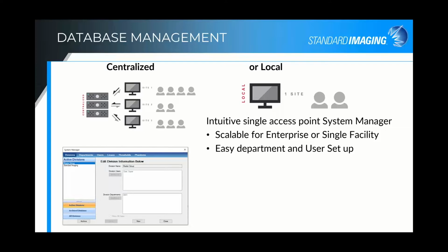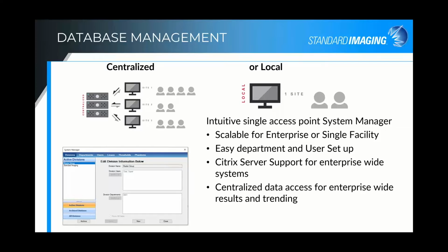Very easy department and user setup for the software as well. It can be set up on a Citrix server, so you can access it from anywhere in the enterprise and any PC in the system. It's centralized data access for enterprise-wide results and trending. So if you are part of a larger group, you can see how the other facilities' results are and compare yours to theirs, etc. So that functionality is there as well.